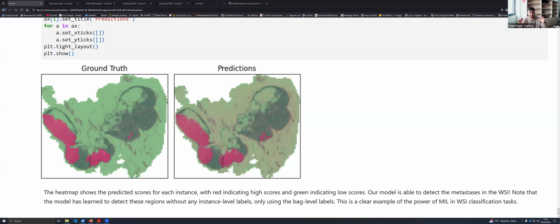So what I said is that imagine you want to get new biomarkers for a cancer, a new type of cancer, and you have whole slide images labeled. You can essentially train a multiple instance learning model and take a look at the attention values, where the model is placing the attention. And maybe you can study those areas to find an important tissue structure or something that can be important to treat that disease. So yeah, that's all.